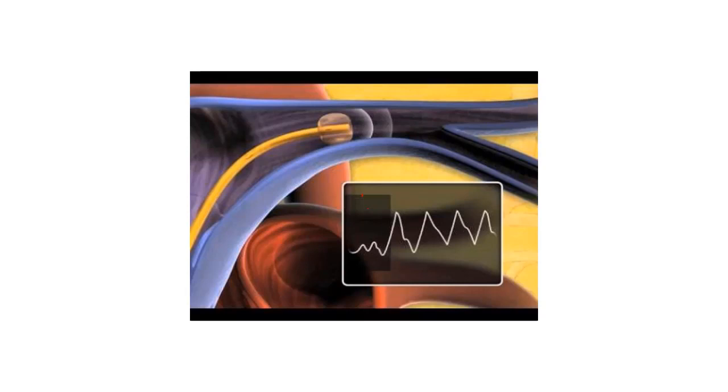Yeah, there it goes. So again, the balloon's down. Okay, now we see our CVP tracing. We inflate the balloon, and we start seeing our CVP tracing over here. We pass through the tricuspid valve, and now we start seeing the right ventricular pressure tracing. We pass into the PA and see it change again. We see that diastolic step-up, and we see that dicrotic notch. And now the balloon's going to get wedged, and we're going to start to see that undulating pattern.